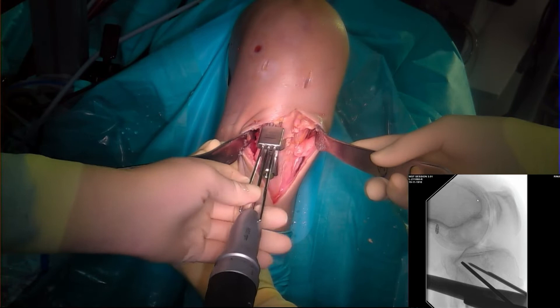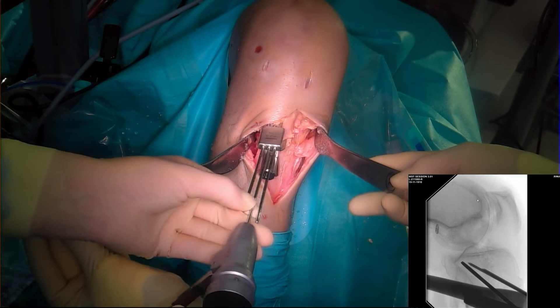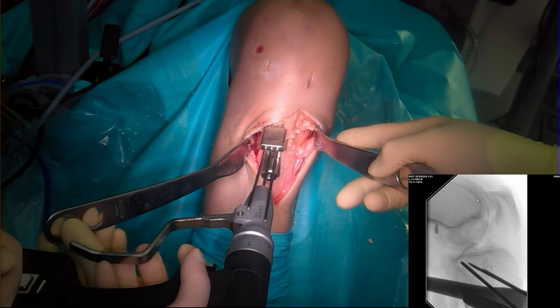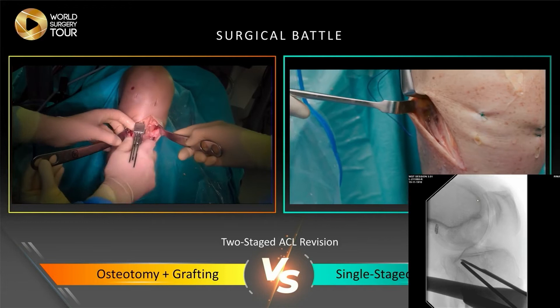It's a device I like very much from AAP because you can predefine your wedge size, and then you're safe with your osteotomy wedge. This is super important, especially for beginners — make sure you put the screws in deep enough. We'll give you some time and go over to Jan.